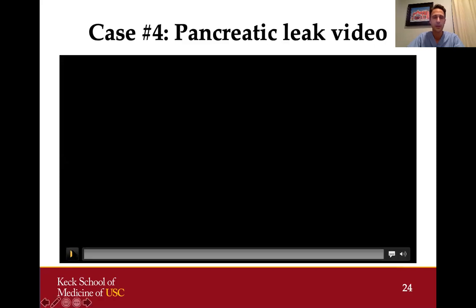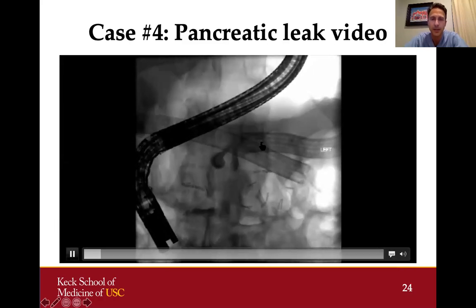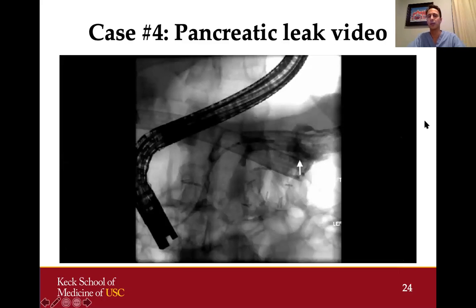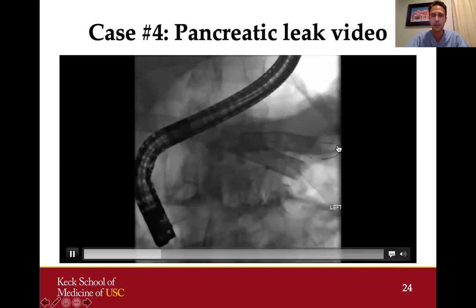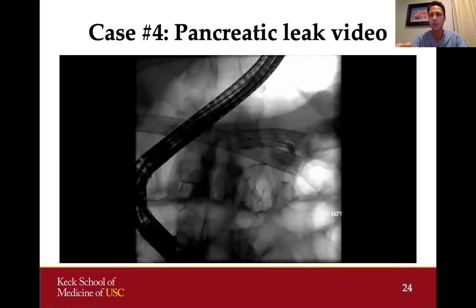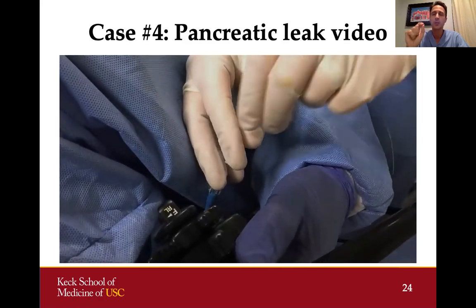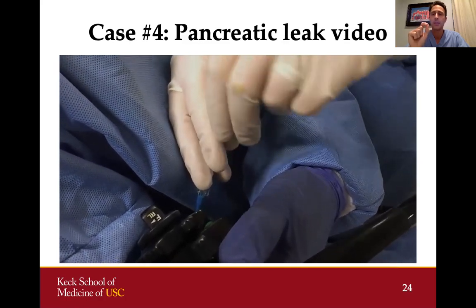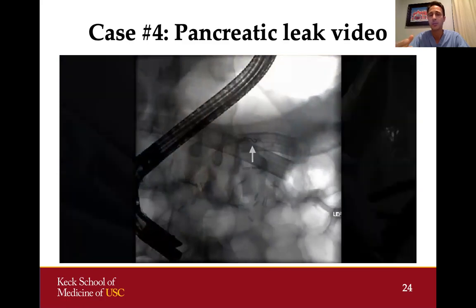Here is a fluoroscopic image where we can see the tip of our catheter as contrast is injected, with a large leak from the stump of the pancreatic duct extravasating at the white arrow. We passed our guide wire all the way through the pancreatic duct into the fluid collection. We injected right at the site of the leak to accurately position our catheter, then placed a figure-eight coil in the distal pancreatic duct just proximal to the site of that leak.